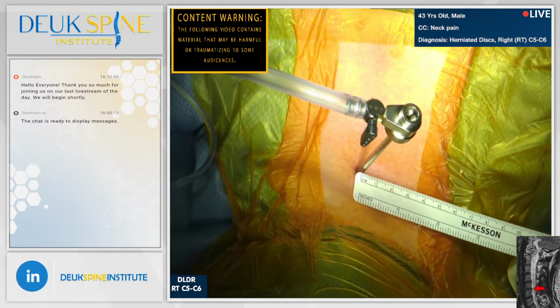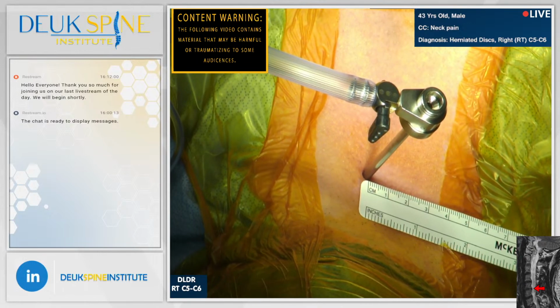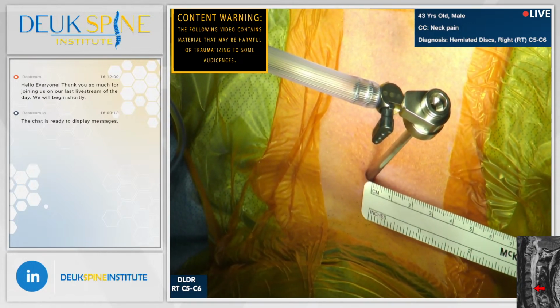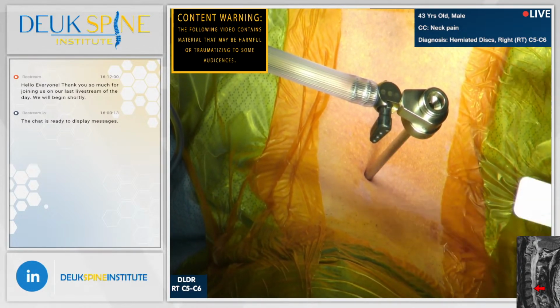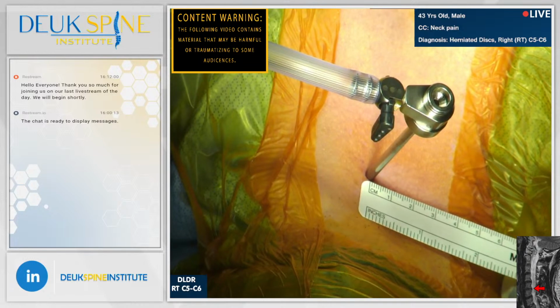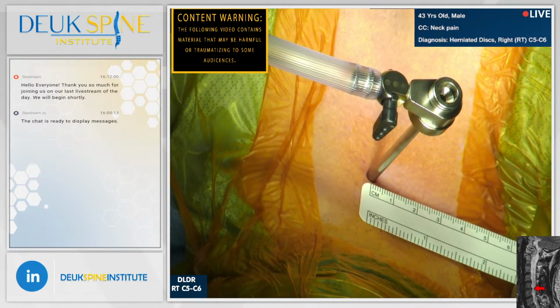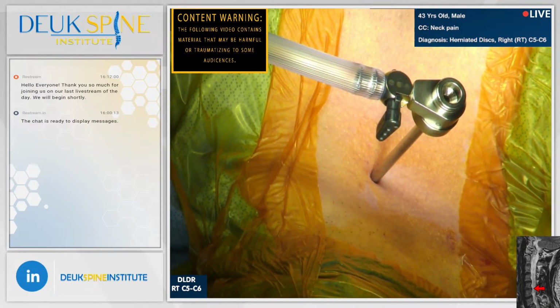So here's the incision, 4 millimeters. You guys see that? Yes, we do. It's a good picture for the site. Nice and clean. Can you get that for the website? Yes. So he's going to have his neck and everything on our new website. I think he's going to like that. You got a good picture? Yes, we did get it. All right. Don't forget.